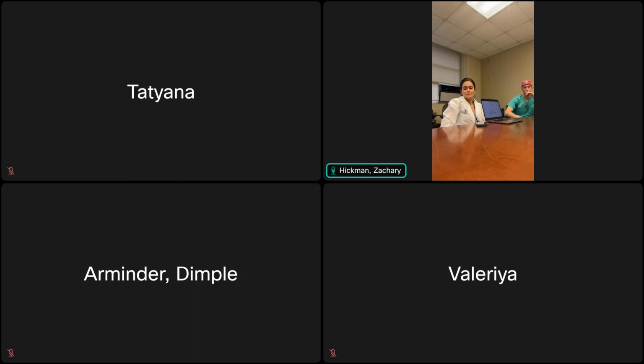Sometimes in the same patient they might start off like that, and then as the edema evolves or gets worse, you may actually see the waveform more clearly because their compliance is decreasing enough to actually see it. You can imagine, if you have a floppy balloon, it's going to be very hard to get any sort of waveform pressure reading in that.